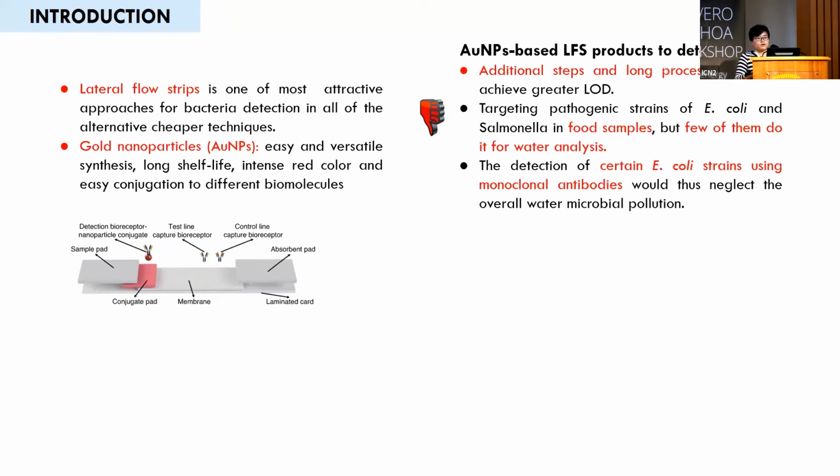These products are normally applied to food sample detection, but few of them are for water analysis. Most of them detect certain E. coli strains using monoclonal antibodies.